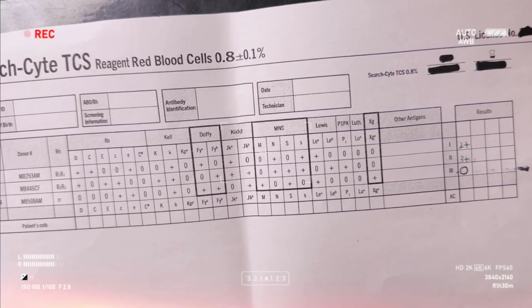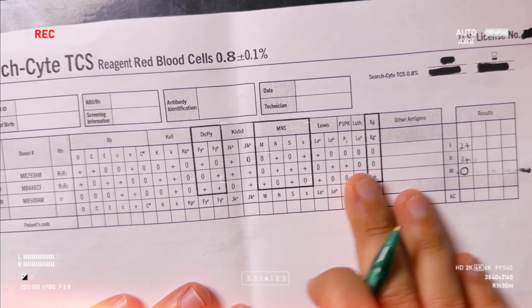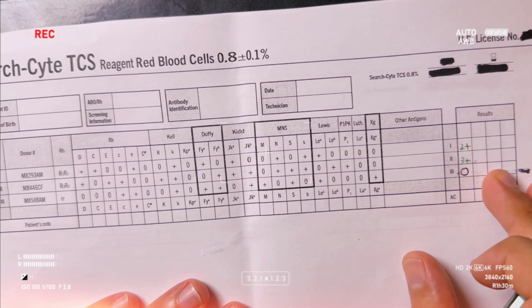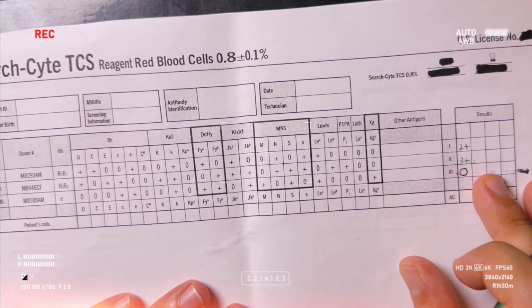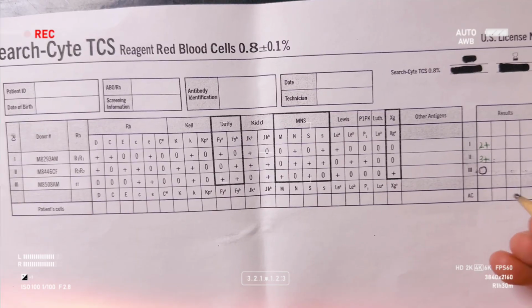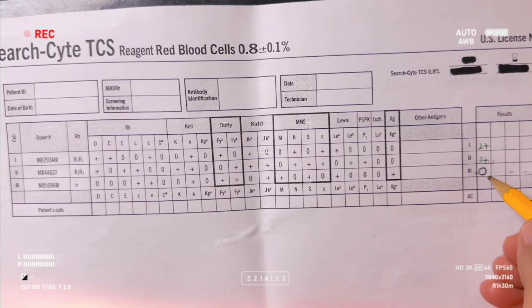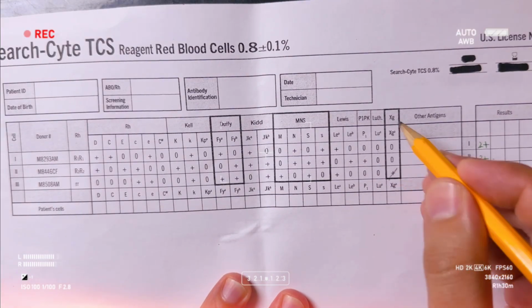So just for practice, I'm doing one more panel for another antibody identification. In this case we have a 3-cell panel, and cell 1 is 2+, cell 2 is 3+, and cell 3 is 0. So let's see what's in that one. This could be different antibodies, so we only use cell 3 because that's the only one with a negative reaction.